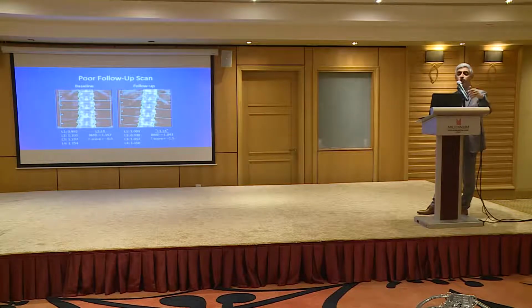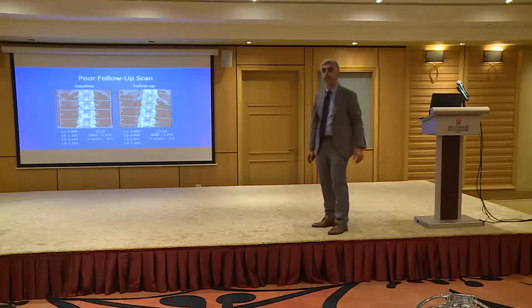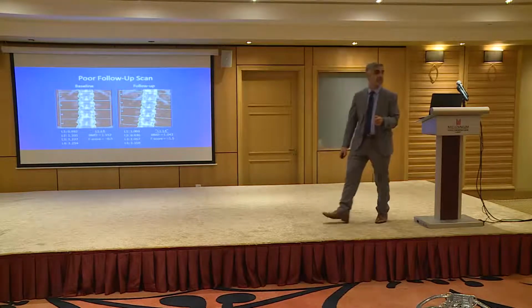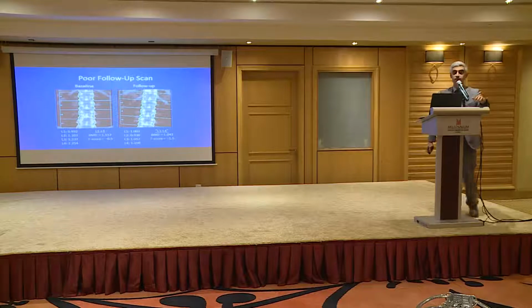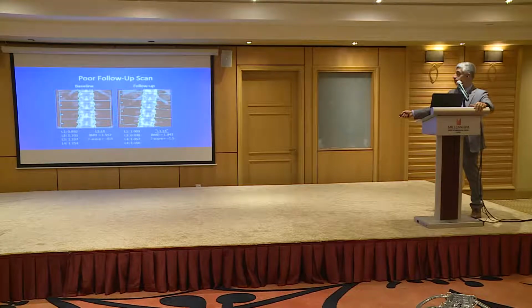Okay, but what's more striking? What about L1? What is L1? Look at the rib. This is not L1. It's T12. Okay? So it was misplaced as L1.